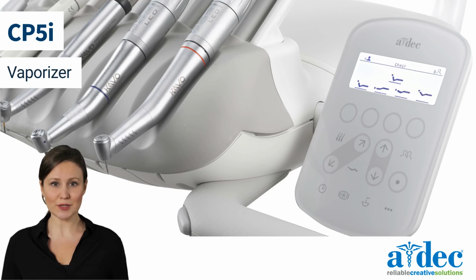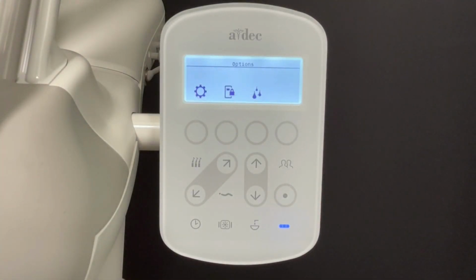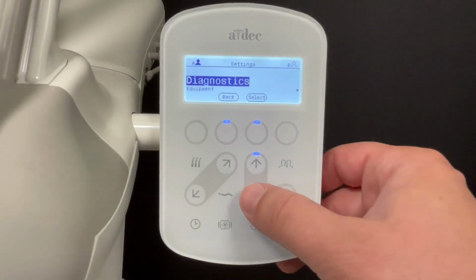In this video, we will discuss enabling and disabling the vaporizer on a CP5i control pad. Begin by pressing the Options menu button. Enter the Settings menu. Scroll down to Equipment.